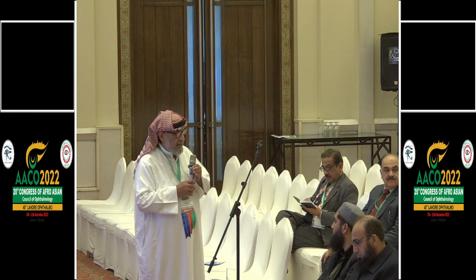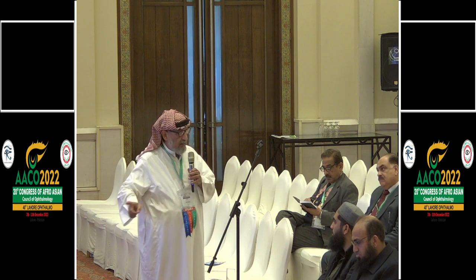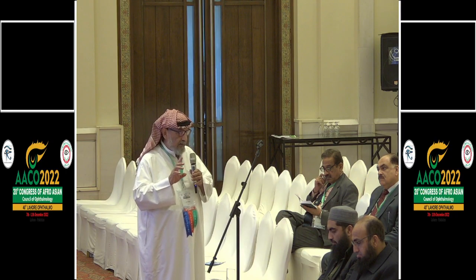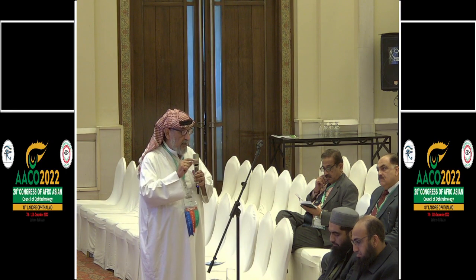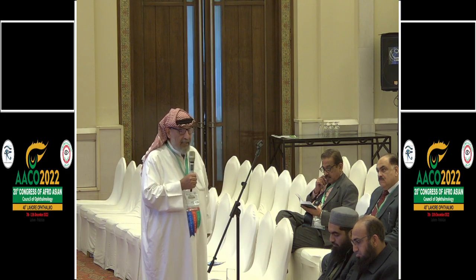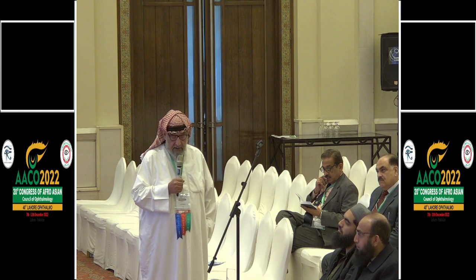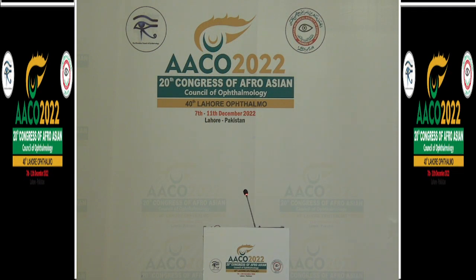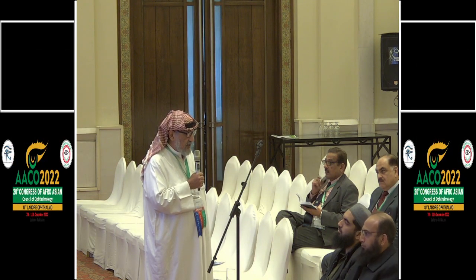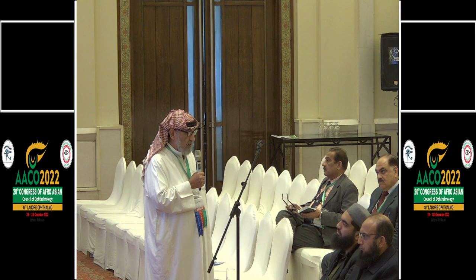As I said, I look at the total corneal power as well as the periphery of the cornea. I look at the center, I look at the periphery. But I don't have anything related to the refractive index of the cornea post-LASIK. And I think if you have femtosecond LASIK, the refractive index should not change that much, because the femtosecond energy is so low and so rapid, so fast.